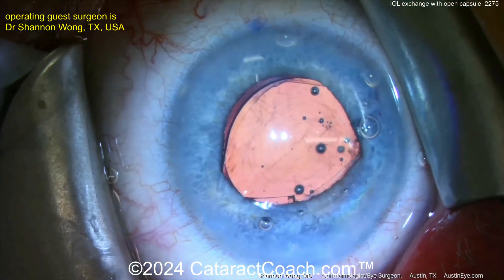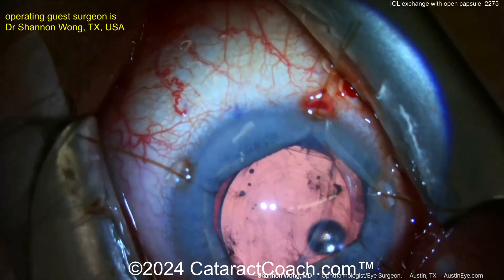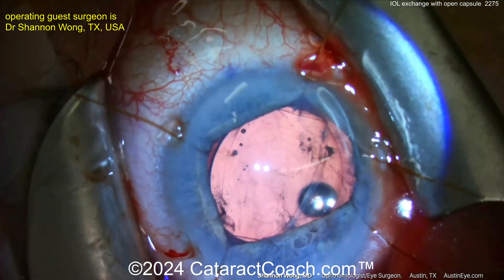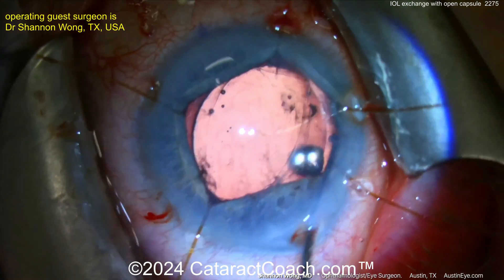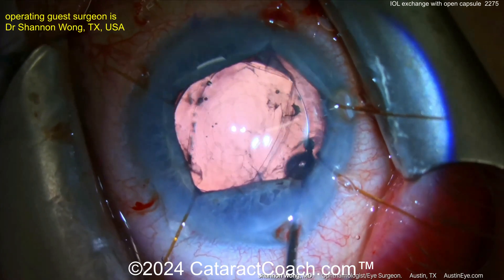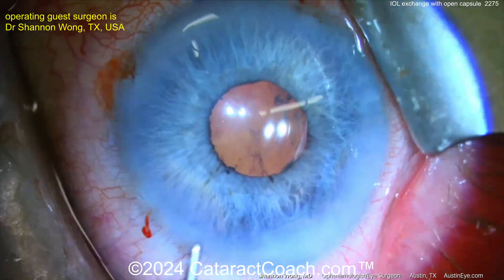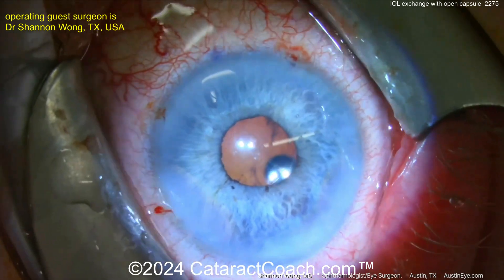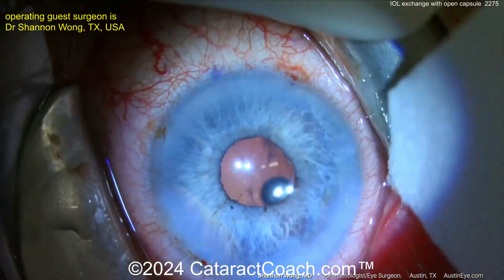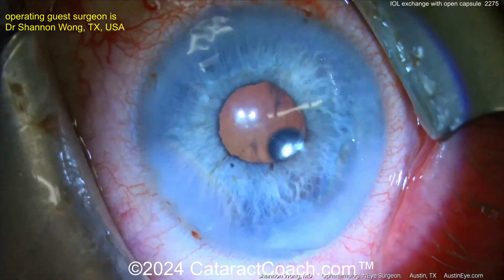Now lift the optic up — Dr. Wong leaves the haptics in the bag and brings the optic more anteriorly. This is a reverse optic capture. You may need to adjust IOL position for that; see cataractcoach.com and look up the rule of nines. At the end of the case, bringing the pupil down — the optic is slightly more anterior, in front of the anterior lens capsule, while the haptics are behind it in the bag. This is reverse optic capture, and at the end it looks pretty good. Note this is off-label use — proceed at your own discretion.